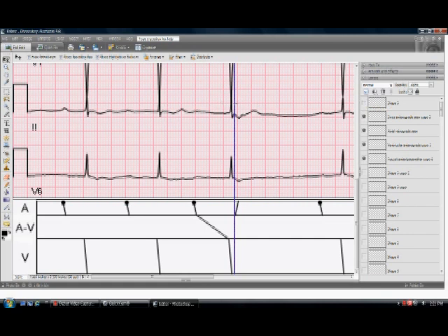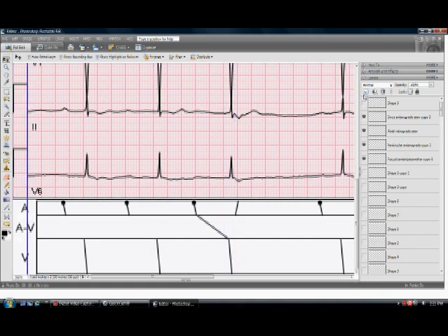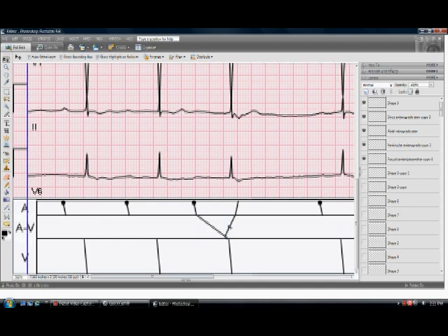And then I'm going to, this is already pre-made, but I've added in an oblique line in the AV tier showing the atrial echo, the re-entry.